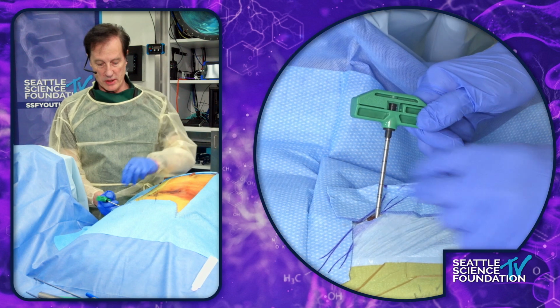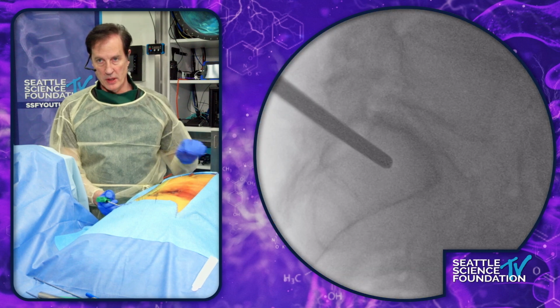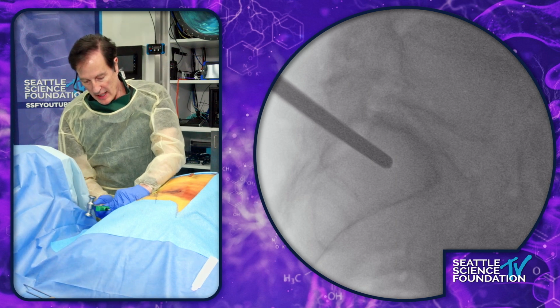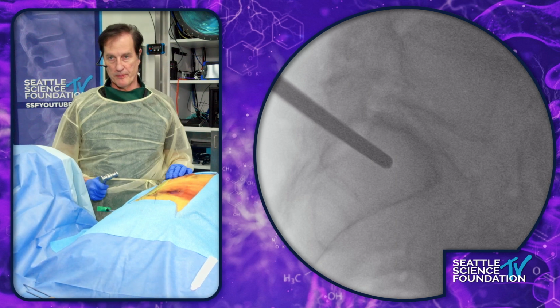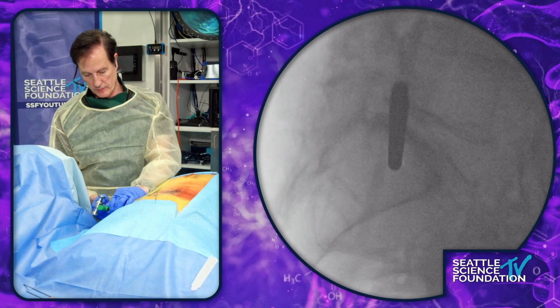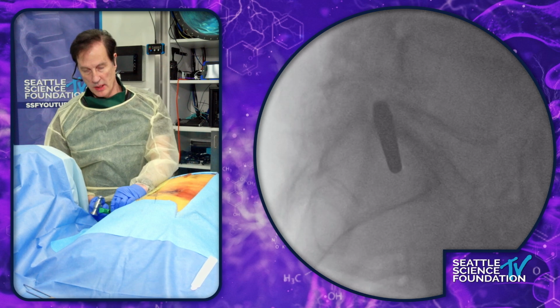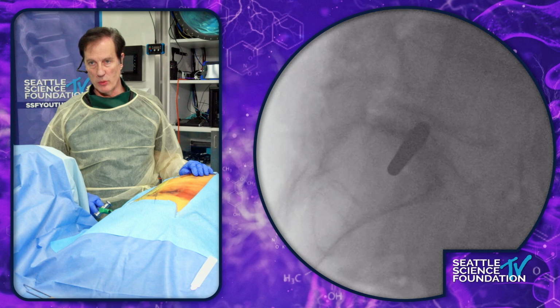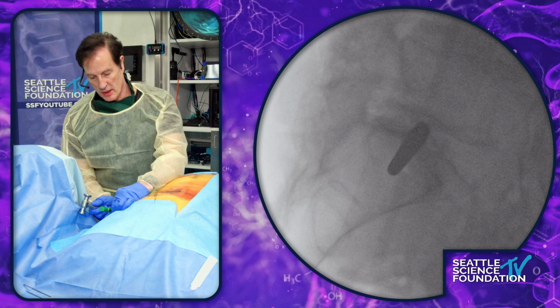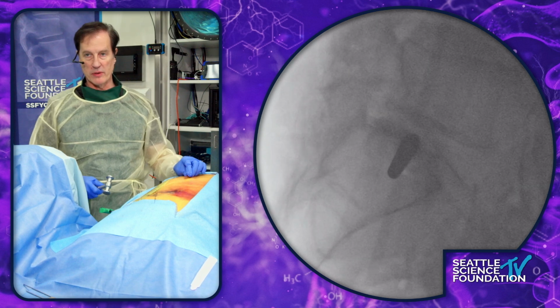And the vestigial disc marks the foramen, picture. That's exactly where we need to be. We'll start off, and this has rigid access, and we'll go in, picture like this. I can hear I'm right at the SI joint. We hear the tone of the hammer taps change, and I'm sure you can hear that. That way we know we're right at the SI joint and we're relatively going in straight.